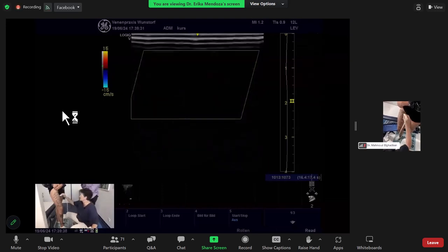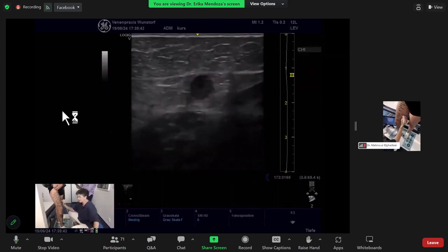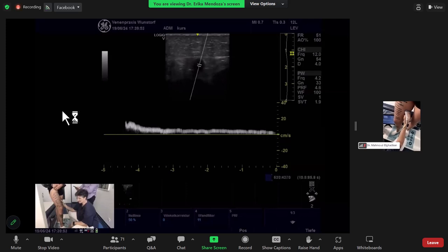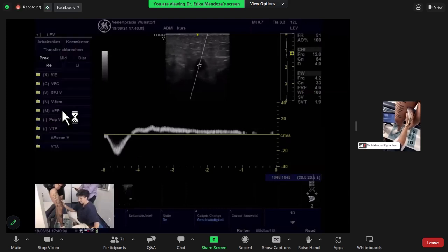Sometimes it's not as clear. Yes, you saw that. I will make the comparison. I make half compression and release. And now we wait a little bit for the system refilling. Now elevate the toe on release. And you see the curves are more or less the same.